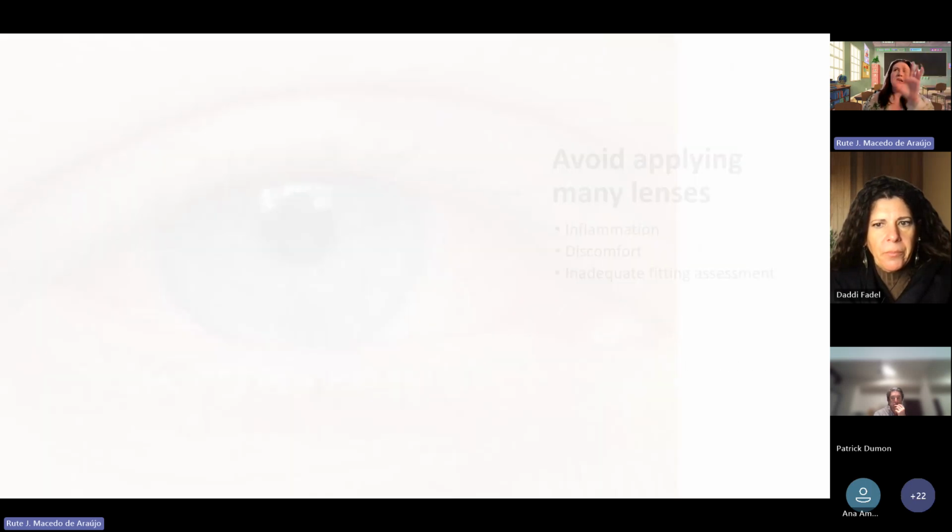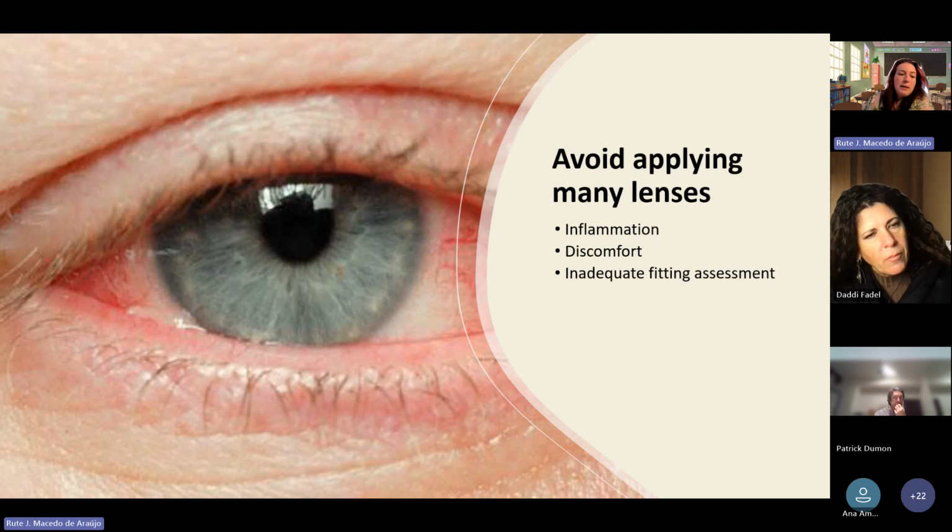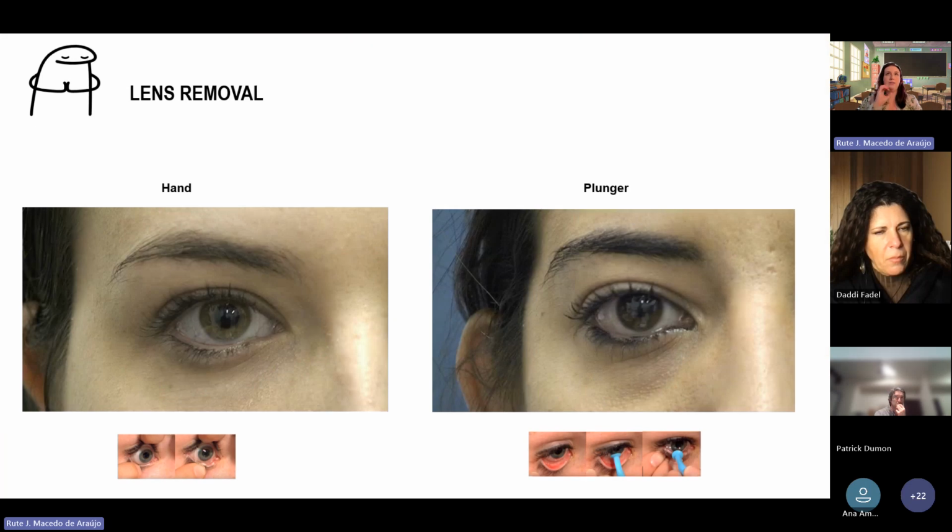So one key aspect is we need to avoid applying many lenses to the patient, because it will be uncomfortable for the patient, create inflammation, and all of that will lead to an inadequate fitting assessment. But sometimes we need to apply more than 2 lenses. And in some cases, it could be necessary to have more than 1 appointment to do that.